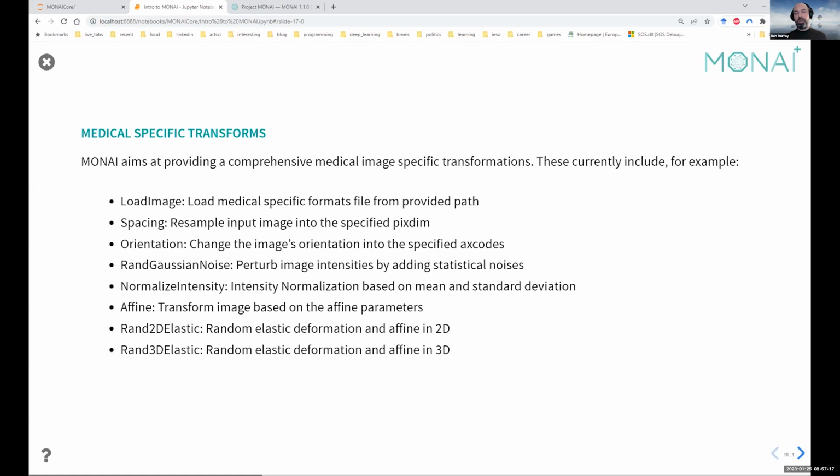So one of the things that people often tend to do is they'll take anisotropic data, which is typically where your X and Y is different from your Z. So your in-plane data is different from the gap between slices of your data. And you might want to reorganize all of that to a common spacing, if your data comes from, say, for example, a collected data set of different scanners and they have different resolutions. It's often the case when you're looking at challenge data.